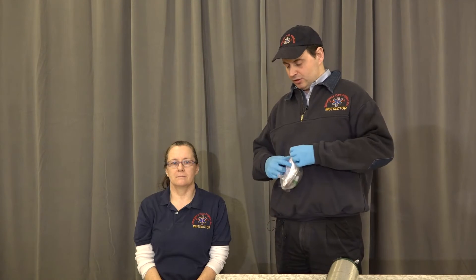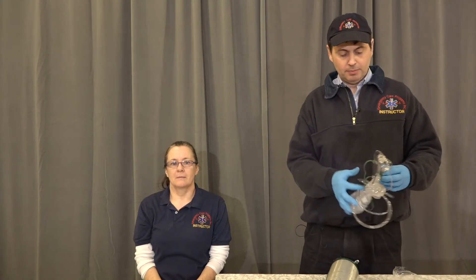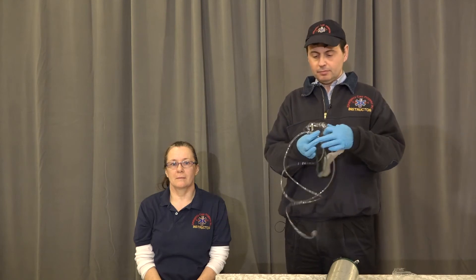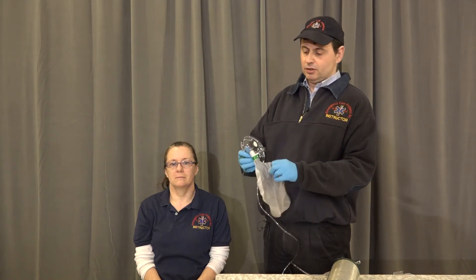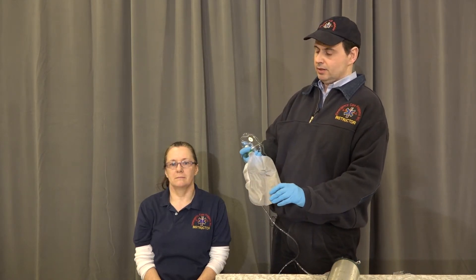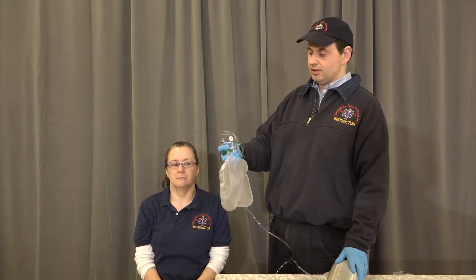Assembling a non-rebreather for our patient who's having some difficulty breathing but breathing adequately. We open up the non-rebreather, take the end of the tubing, put it to the port on the regulator, set the flow meter to 12 to 15 liters per minute, and we're going to inflate the bag prior to placing it on the patient.